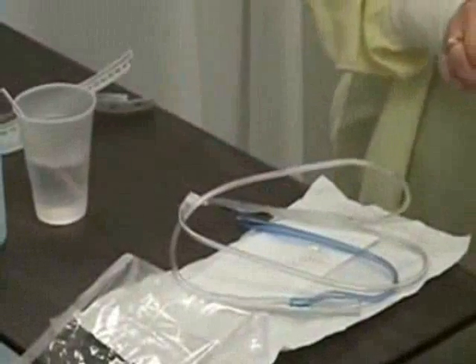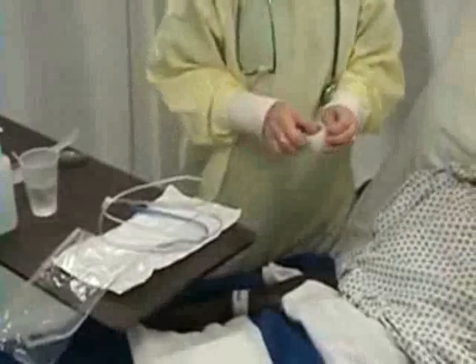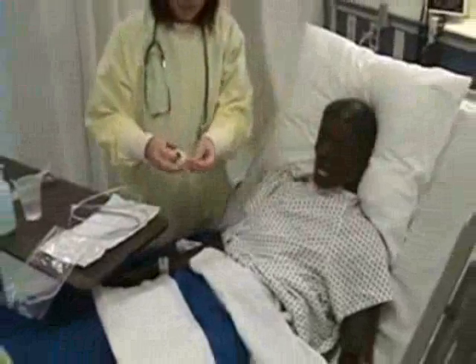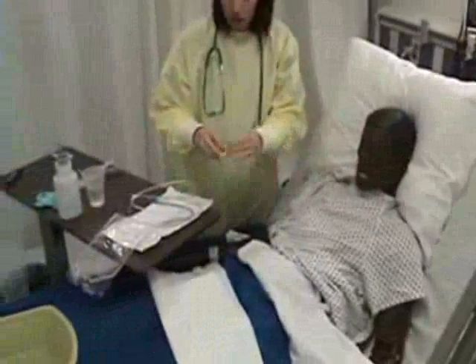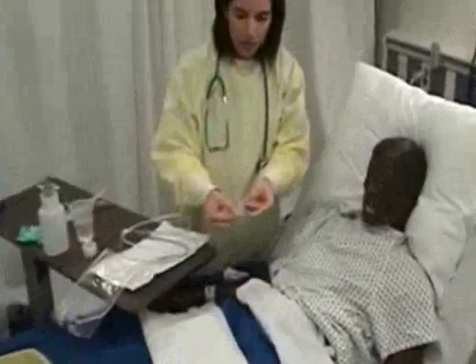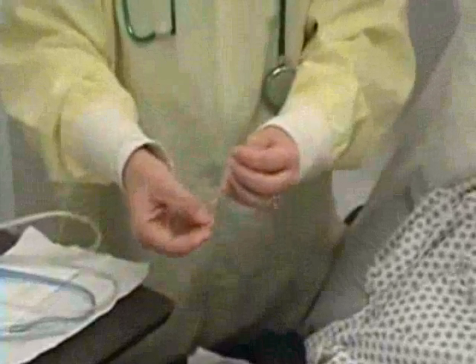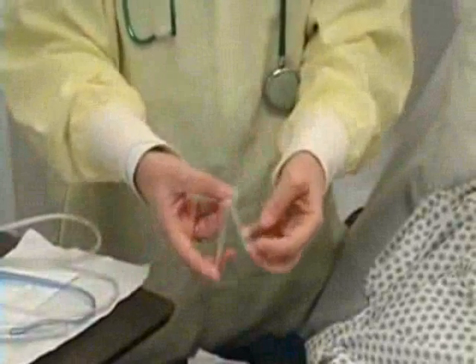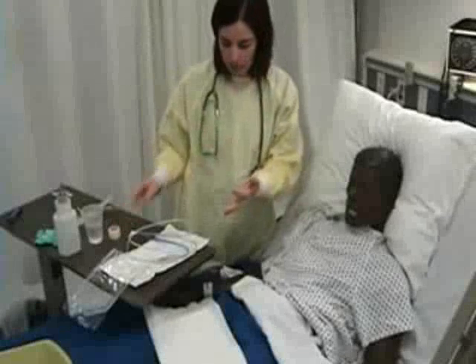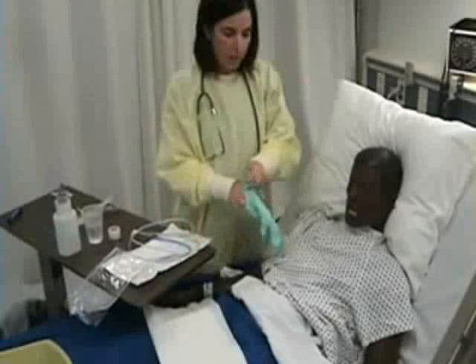I also want to tear a piece of tape to use to secure my NG tube to my patient's nose once inserted. I'm going to tear a piece maybe 3 to 4 inches long and split part of it in half so it looks like a pair of pants. I also am going to tear 1 extra piece of tape to secure my tube. I'm going to put my gloves on.